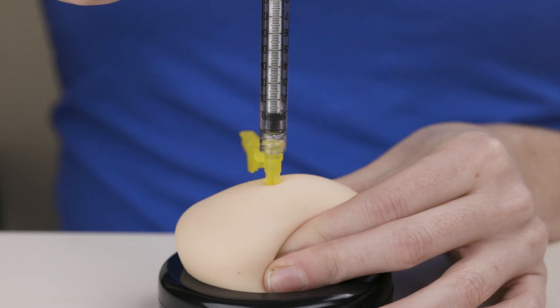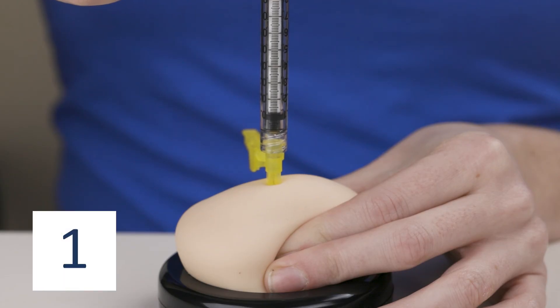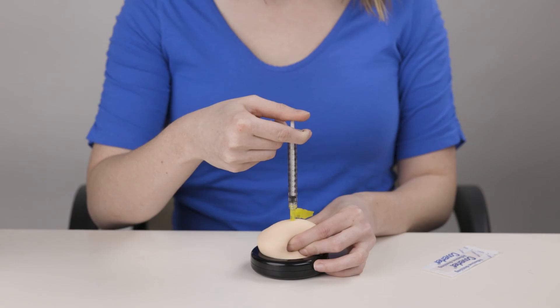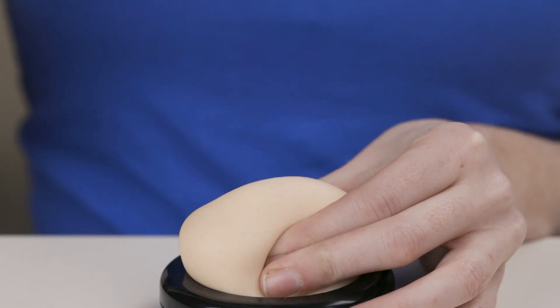Count slowly to 5 after all of the medication is injected. Then pull the syringe straight out of your skin. Let go of the pinched skin.